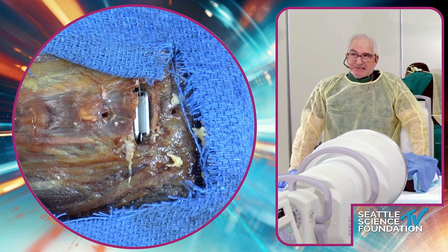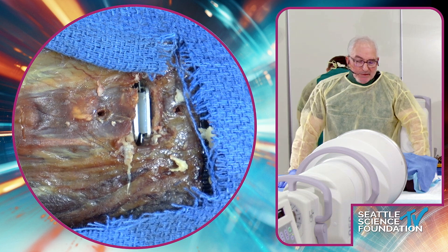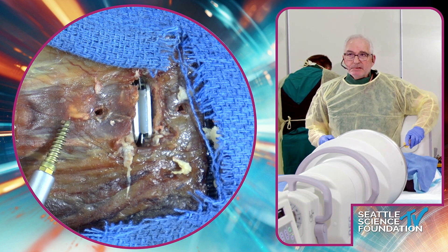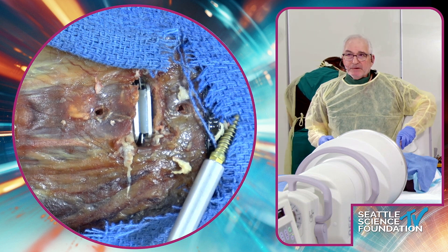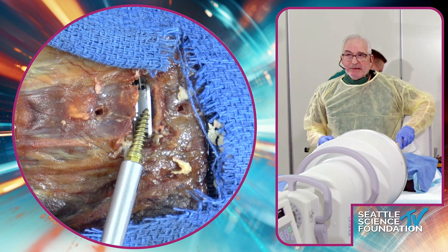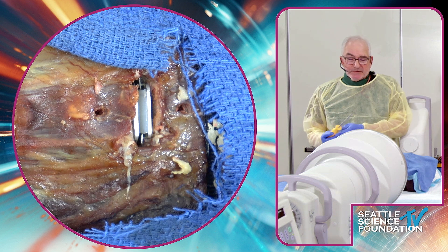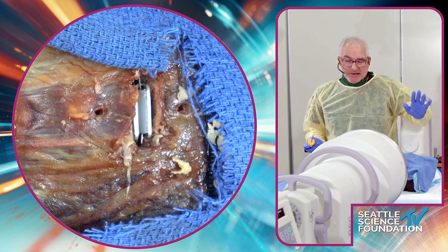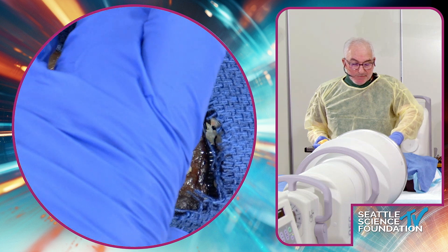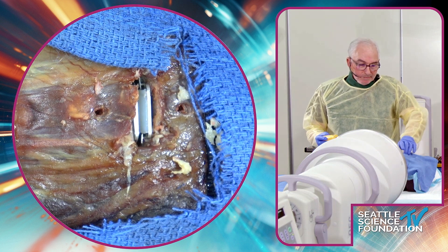Let's say this one is mechanical — orient us for cephalad. What we have is a superior-inferior disk that we're going to explant and do a revision for. We're going to say this is for mechanical reasons, not for infection or osteolysis. For exposure, you can go through the same incision or the opposite side — it really doesn't make a difference, whatever you're comfortable with.